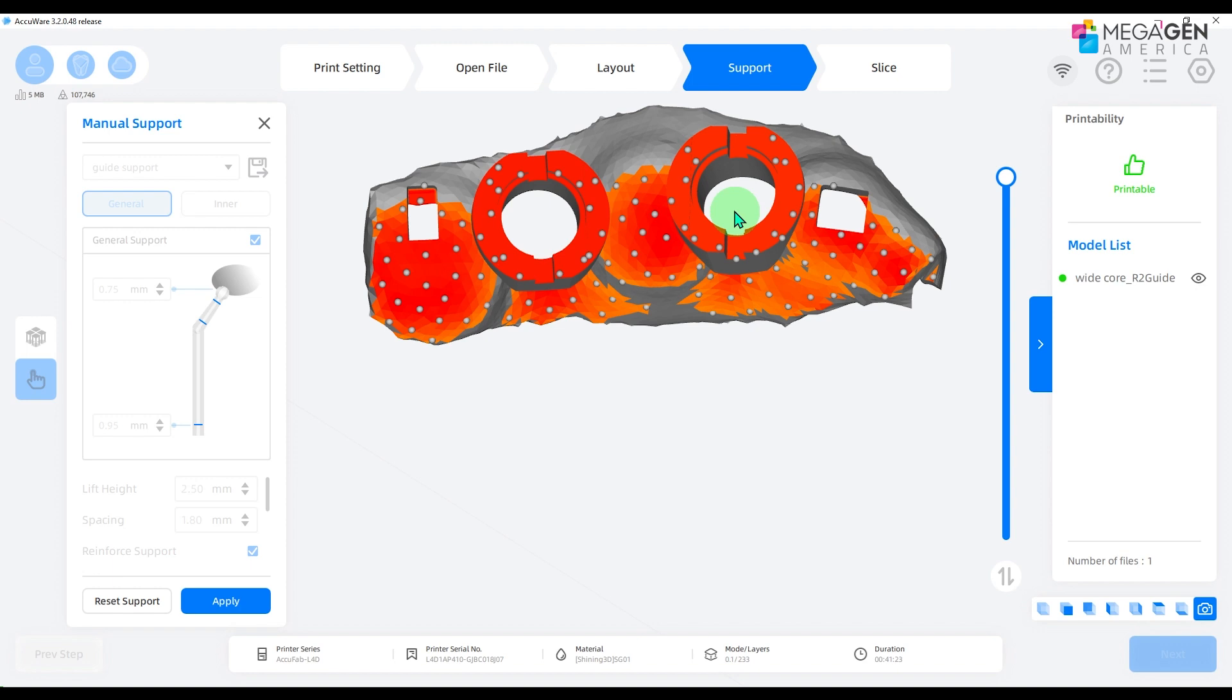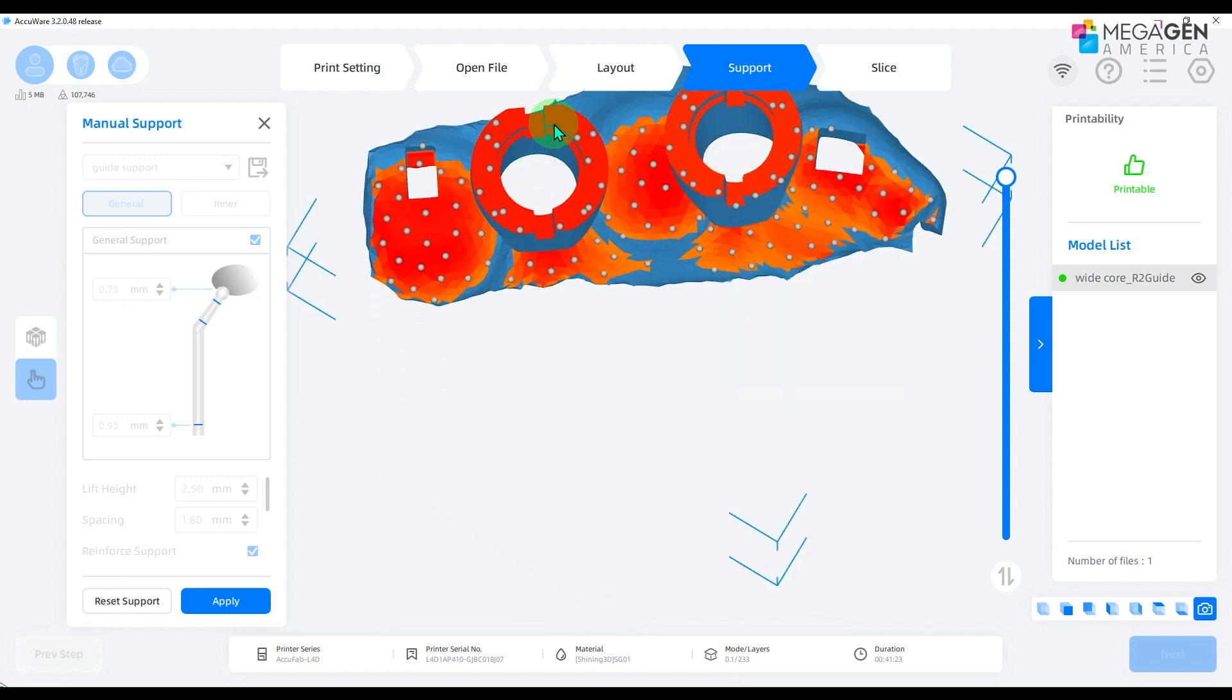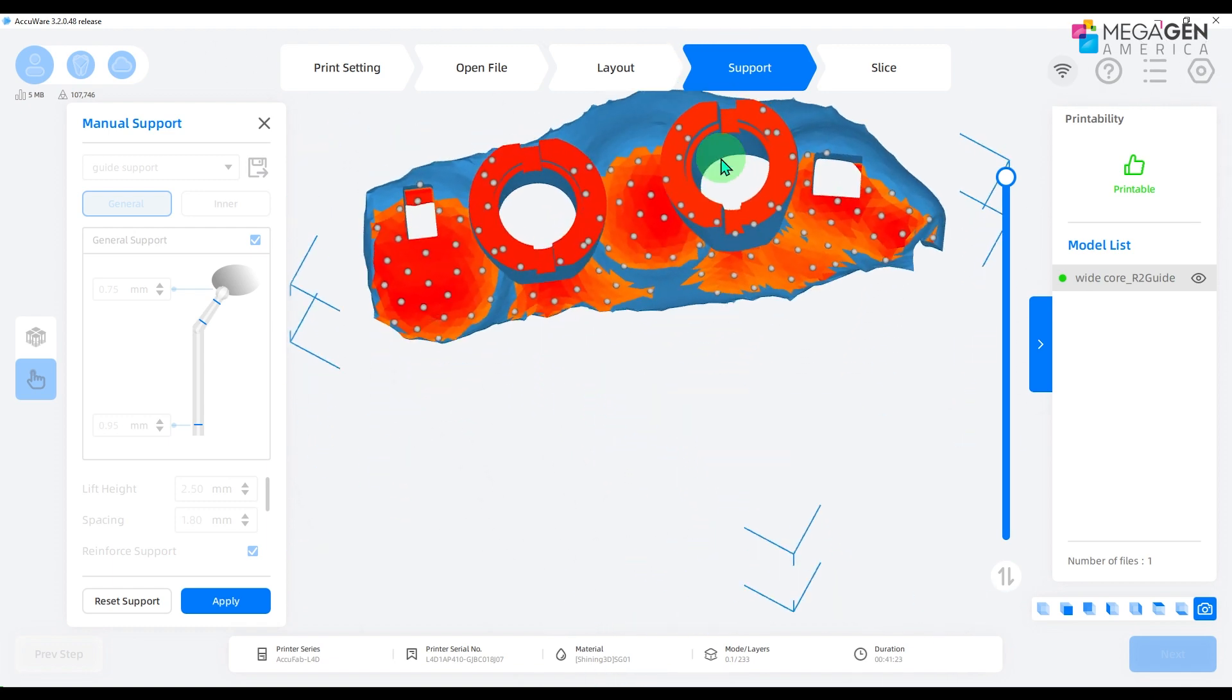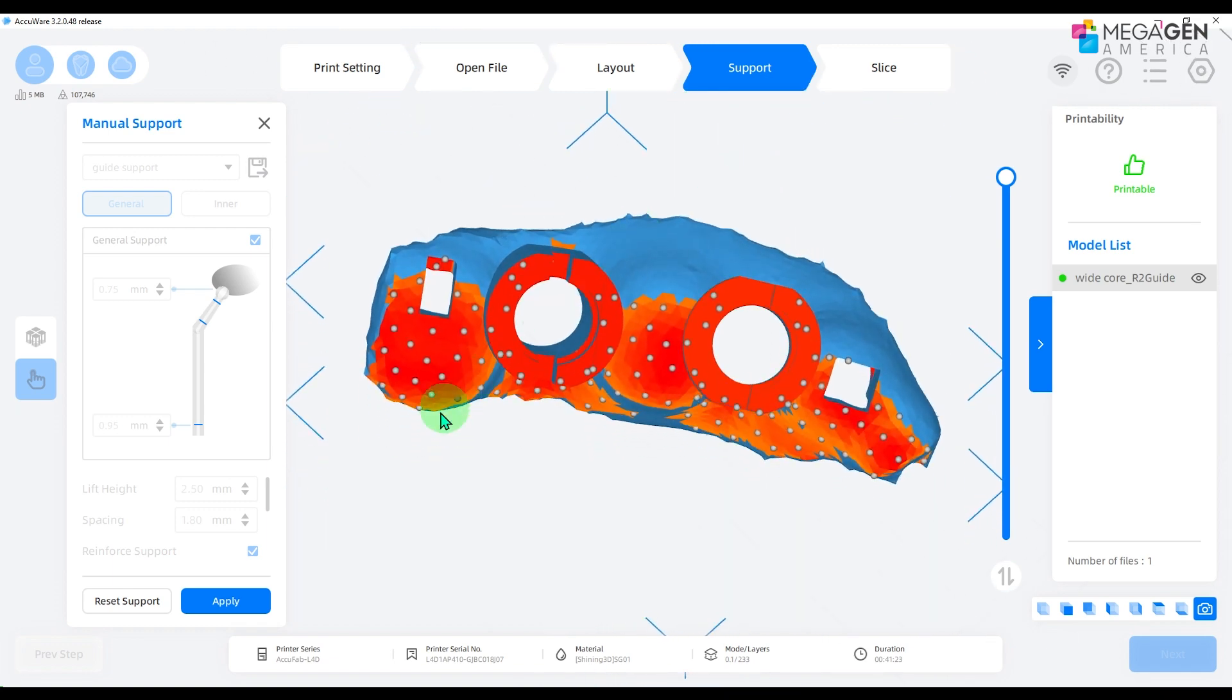Left click on the dots to delete the supports or click on an empty area to add additional supports. If you are satisfied with the location of the support, click the blue apply button on the left.